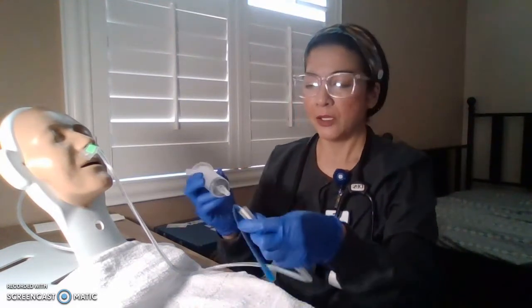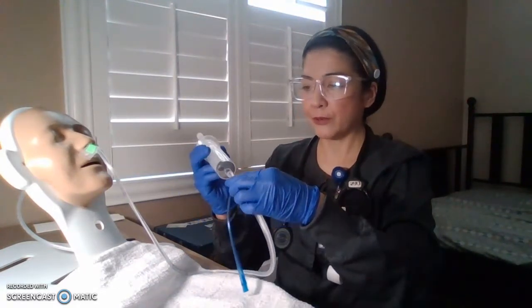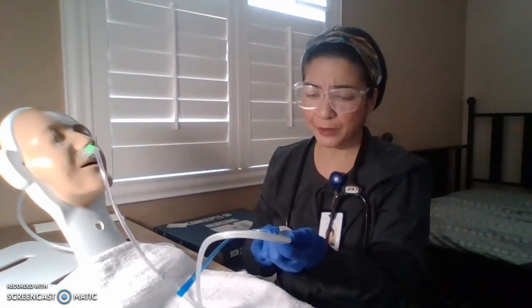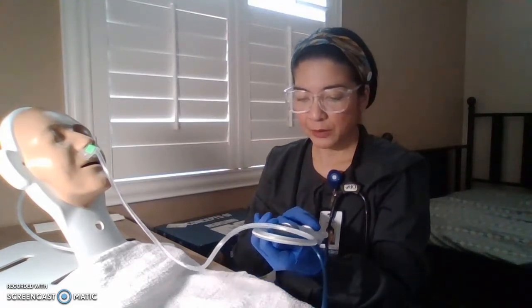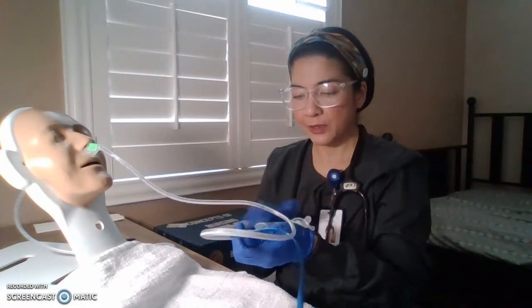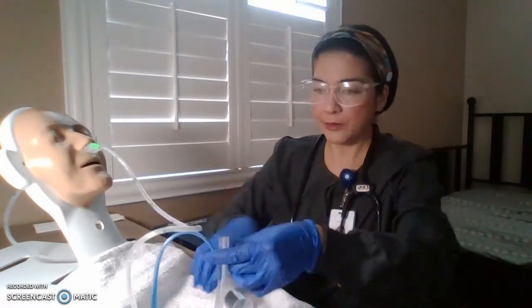All right, so another check would be through pH content, pH level. So what are we going to do? We are going to put our syringe, and we're going to aspirate just a little bit. We don't want to take too much away from the patient. All right, 10 mLs. There we go.